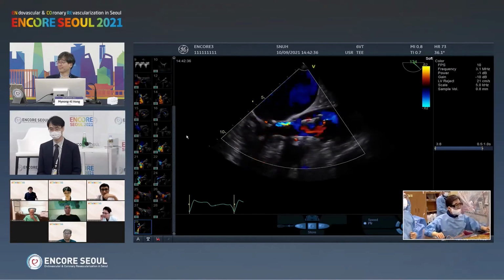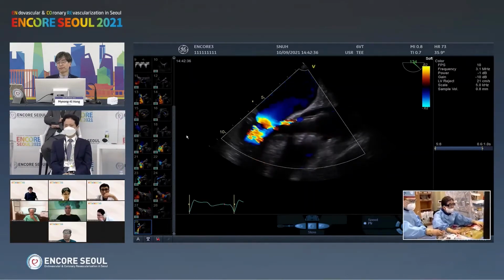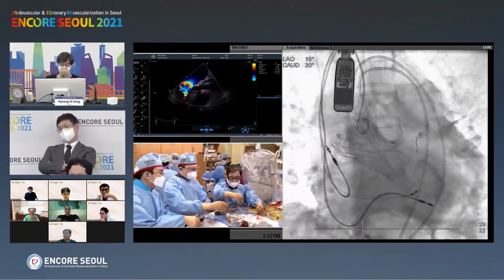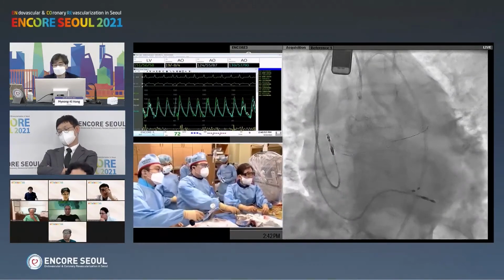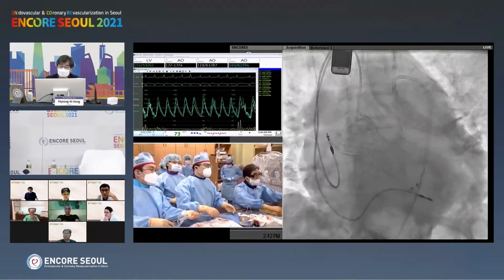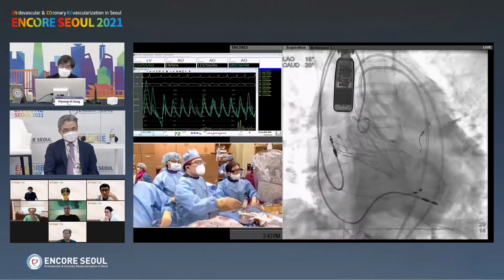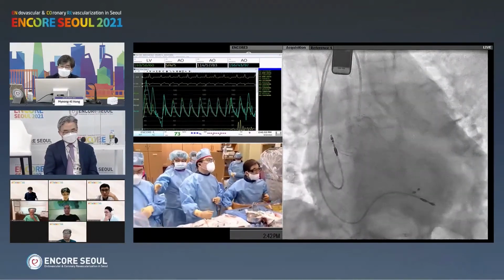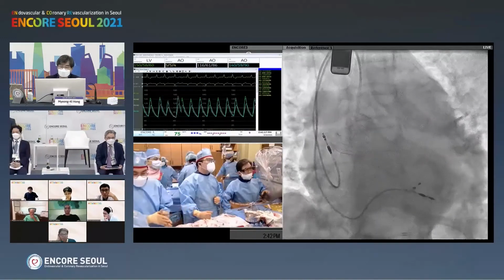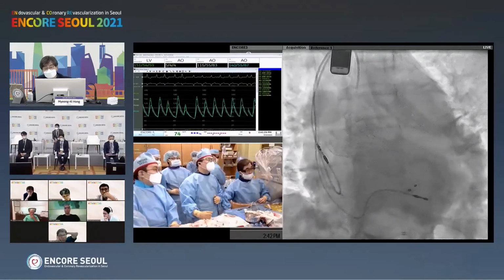Then I'm going to remove the left guiding system because we are sure that coronary obstruction will not happen. Okay, I can show you the other projection root arterography to make sure, given a little bit of discrepancy between angio and echo and hemodynamic data.